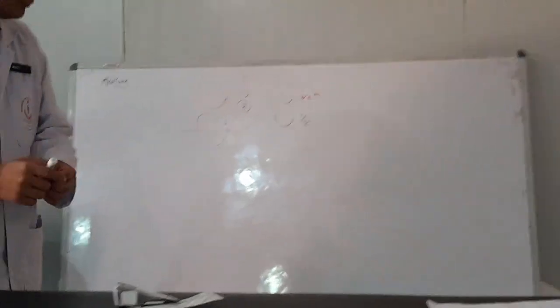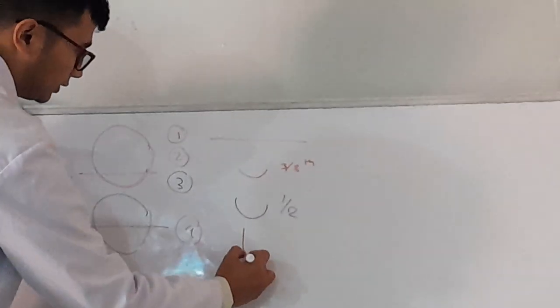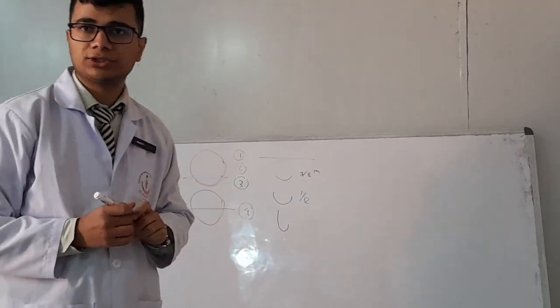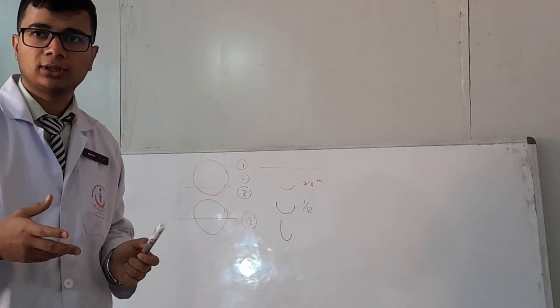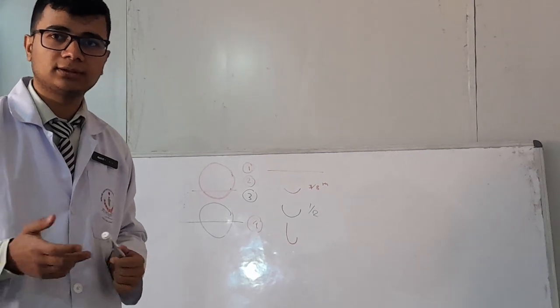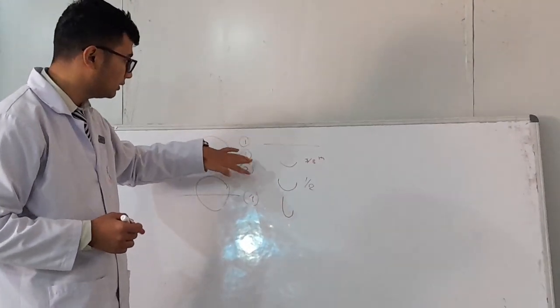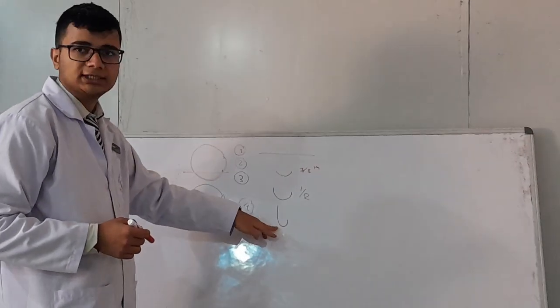Another type of suture needle which is used commonly is the J-shaped suture needle. This J-shaped needle is commonly used to navigate around narrow structures, like while suturing a port wound, and it is also used in the anal canal or in the vaginal region. So these are the basic four types of suture needle which we need to understand at our level. The first one being straight, another is 3/8, another is half, and another is J-shaped.